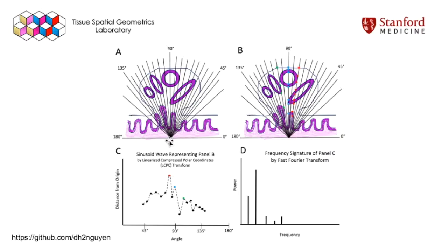By applying this grid of 0 to 180 degrees, we divide this image into individual sectors represented by these radial lines. If we wanted to measure the tubiness of this polyp, then we mark every time one of the radial lines crosses the border of a tube.